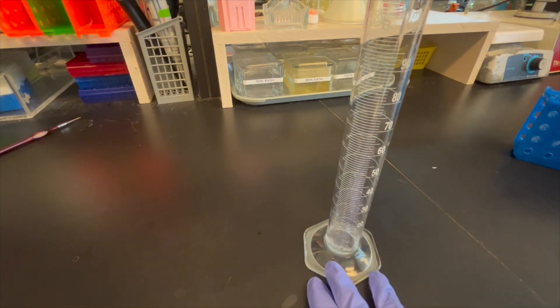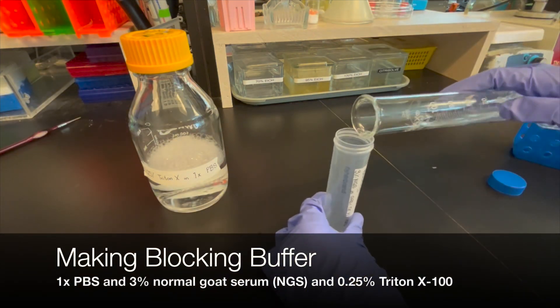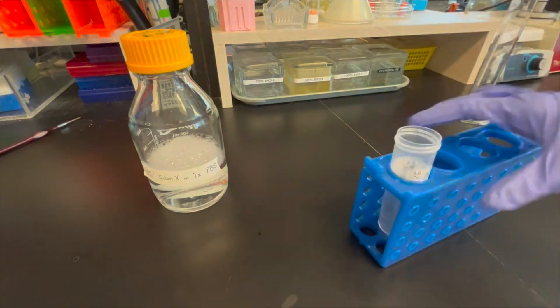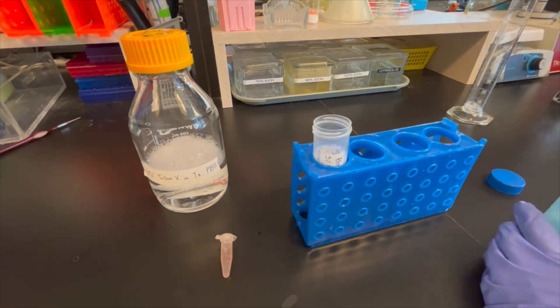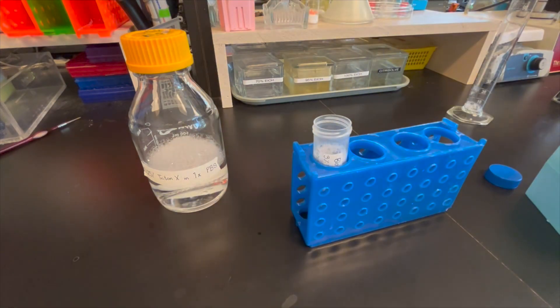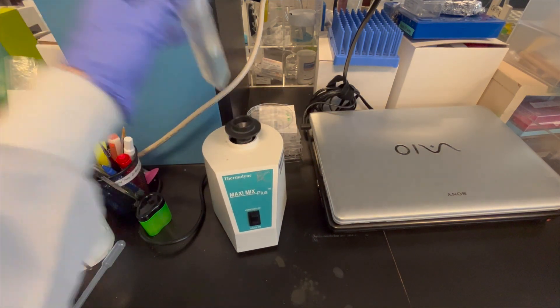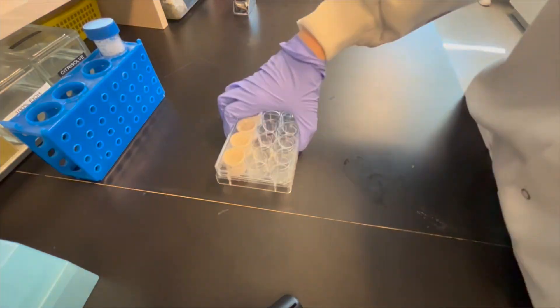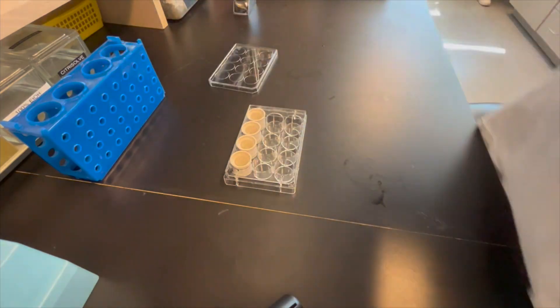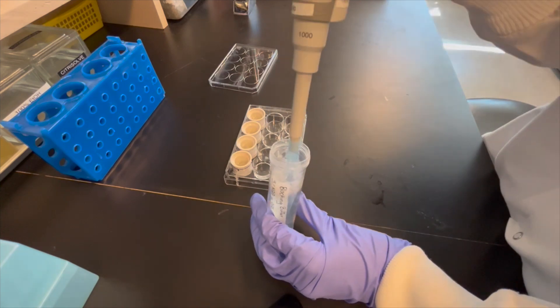Next, pre-incubate the slices in a blocking solution made from 1x PBS, 3% normal goat serum, and 0.25% Triton X-100, and leave on the belly dancer for about one hour. Fill each well with about 2 milliliters of blocking solution. This step is done to reduce background staining, as the serum will nonspecifically bind to substrates within the cells.